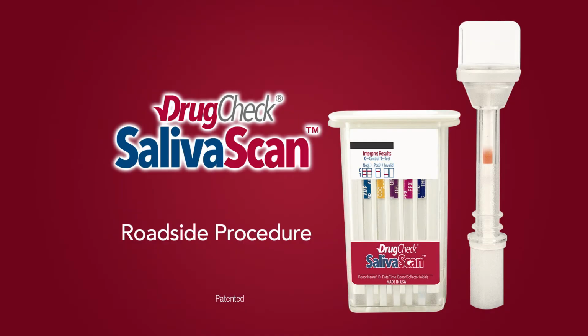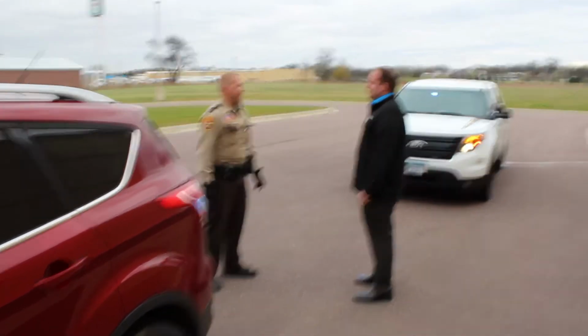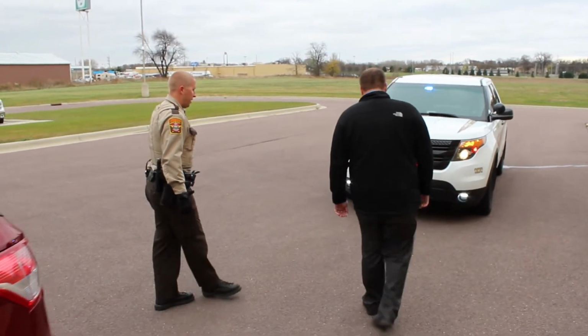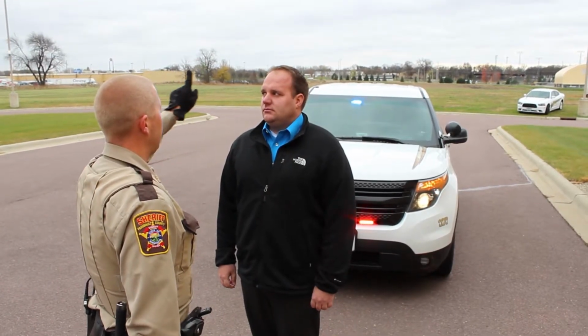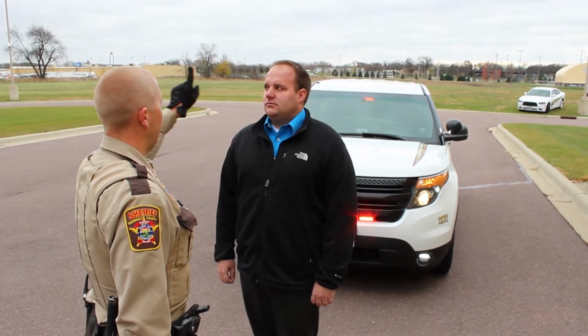DrugCheck SalivaScan roadside procedure. One of the important roles of law enforcement officers is identifying impaired driving. While the level of training and experience varies among officers, all are responsible for conducting thorough and complete investigations to establish whether certain drivers are impaired and unable to lawfully operate a vehicle.